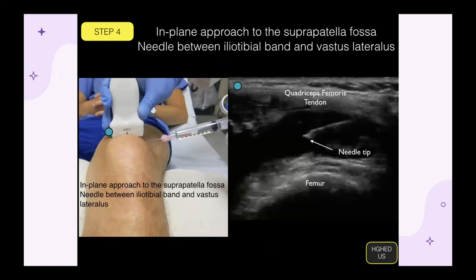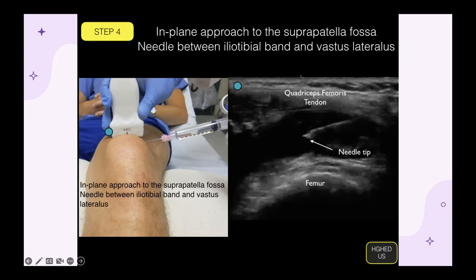Ultrasound can not only be used as a diagnostic tool but also as a guide. Using ultrasound, we can quickly determine whether medial or lateral will be better for arthrocentesis, depending on the amount of fluid. As shown here, the probe is used to visualize the needle as it is inserted to remove the fluid. The needle can be inserted right next to the probe and you can see it go down through the layers, or you can measure down to the anechoic area and insert the needle from the side. The same can also be done for steroid injections given to reduce inflammation. Compared to blind injections, ultrasound-guided injections logically increase the success rate due to the ability to see where the needle is inserting.